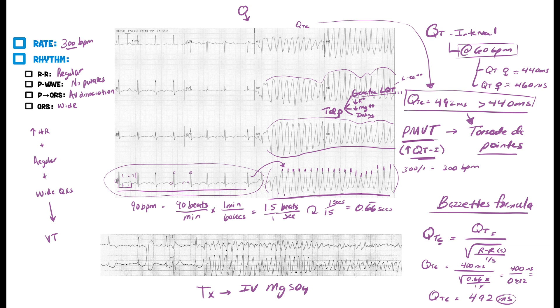Looking at this other EKG down here, you can see this nice twisting look — they say it's supposed to look like a ribbon. You can see how it twists: points where you have high QRS complexes, then little QRS complexes, then back to high, then back to low. This is Torsades de Pointes. Let's move on to the next EKG, which is going to be V-fib.